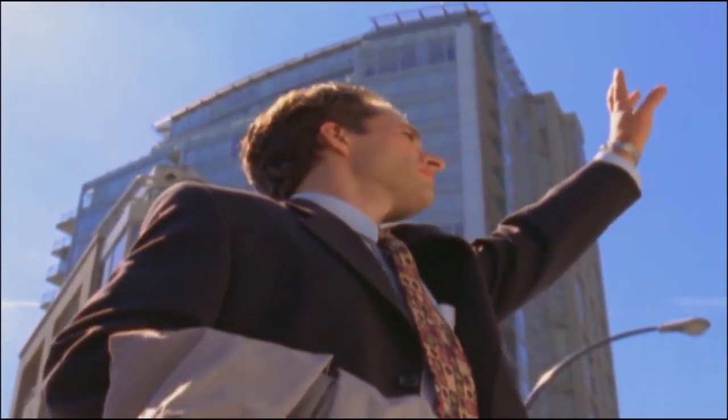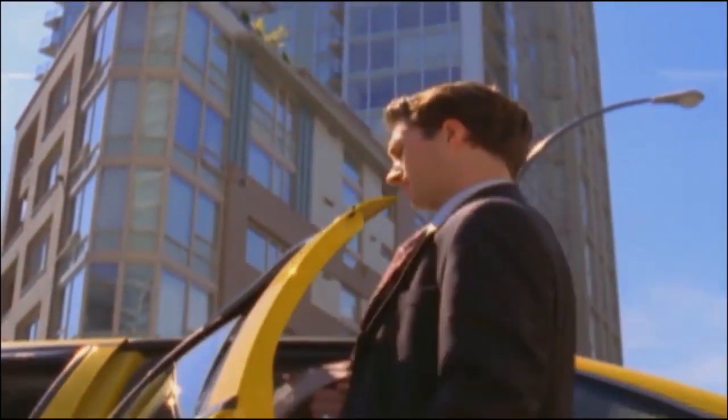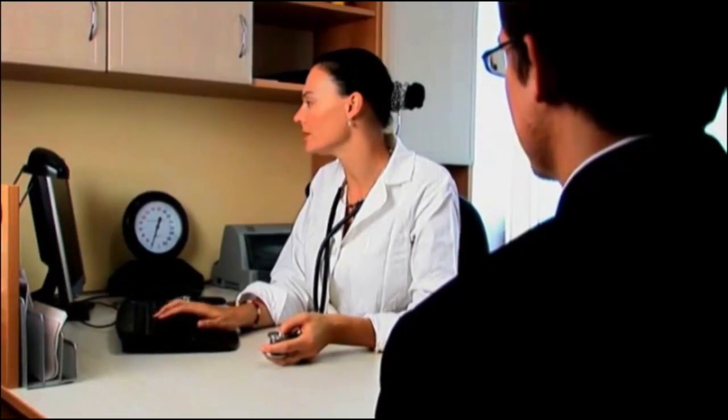You will be monitored for about 45 minutes before you can return home. Another person should drive you if you received relaxation medication. Your doctor will prescribe medication to ease the temporary pain from the procedure. A discography is not a treatment, but a diagnostic tool to determine the source of pain. Your doctor will discuss your results and options for future treatment after you receive your diagnosis.